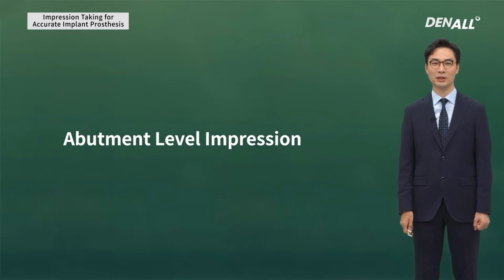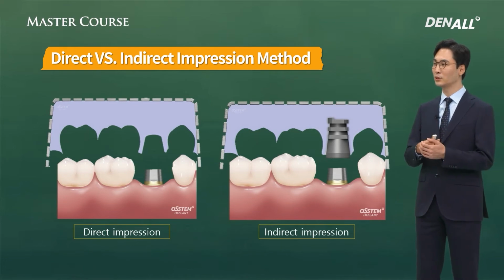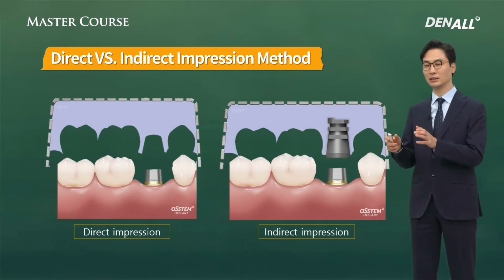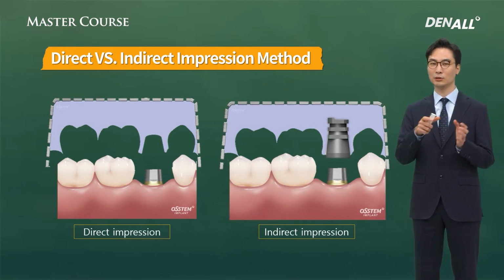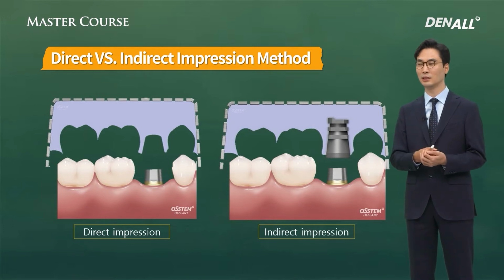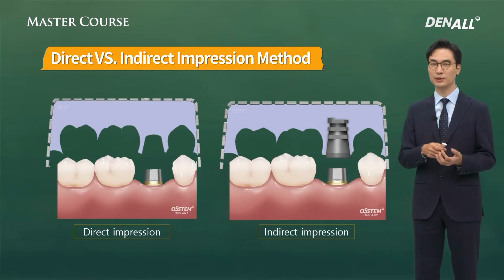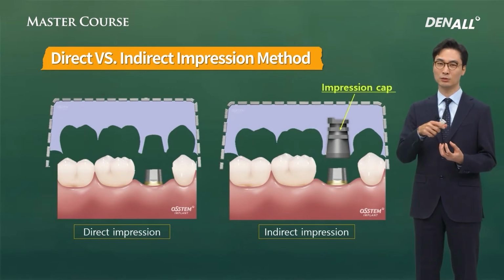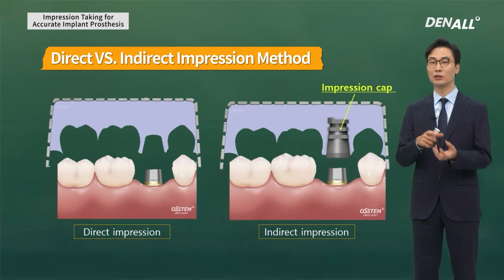First, let me talk about abutment level impression. As mentioned earlier, abutment is connected and this is prepped or not prepped like a natural tooth and impression is taken. This is direct impression taking method. If you use impression cap or impression coping and proceed with indirect impression, this can be a choice as well.